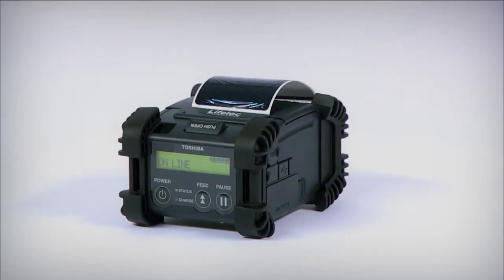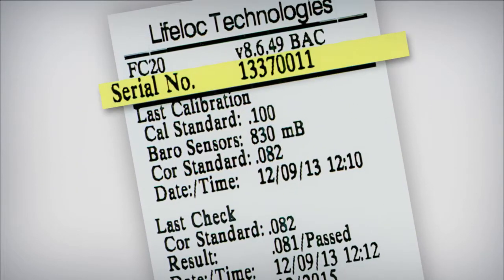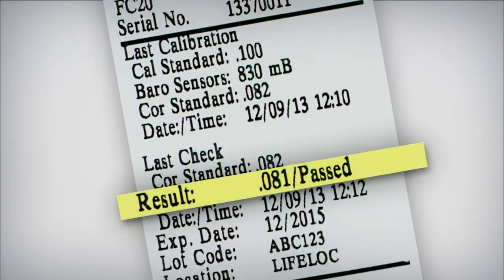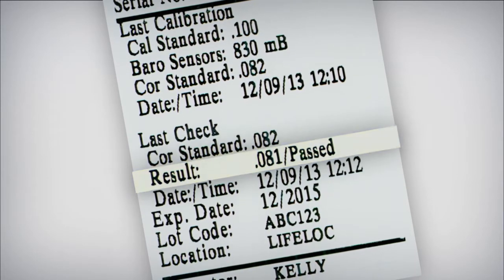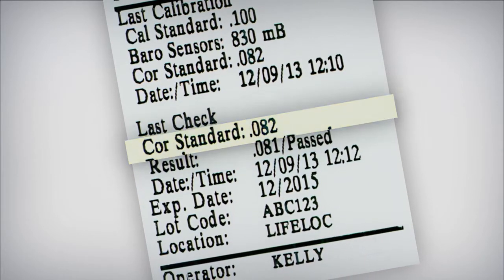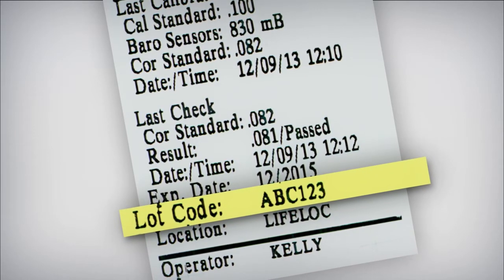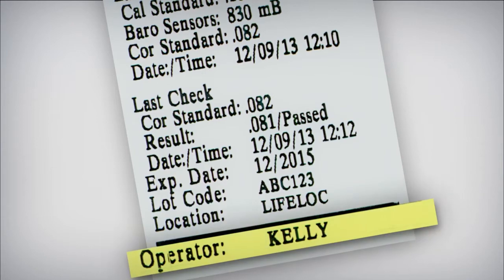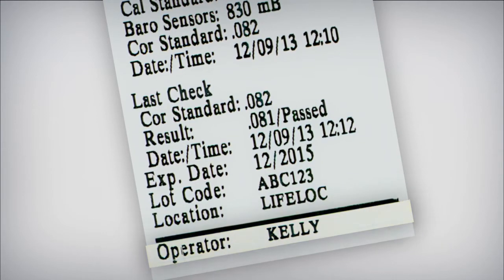Each printed record includes unit serial number, date and time, result, pass-fail and digital, gas standard, gas cylinder lot code, gas cylinder expiration date, operator, and location ID.